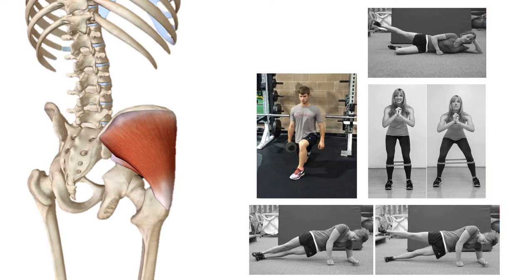So anyone with weak hip abductors, and there's a lot of us out there, I know I've got weak hip abductors, contralateral lunging is perhaps the way forward. And we would not know this without EMG.